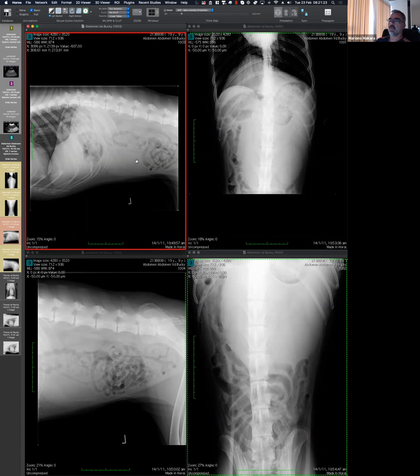So, options, what are your differentials? Maybe we need to try, I don't know if we're going to end up in a perfect agreement, but what do we think about fluid or not fluid?